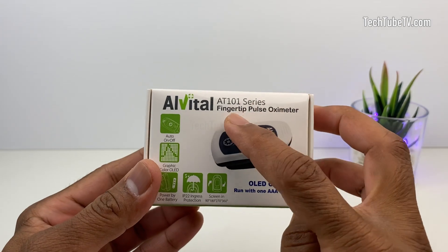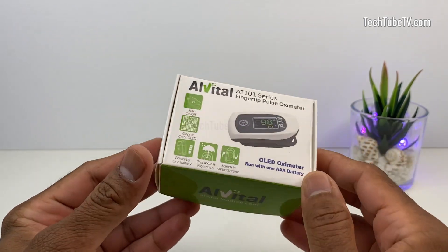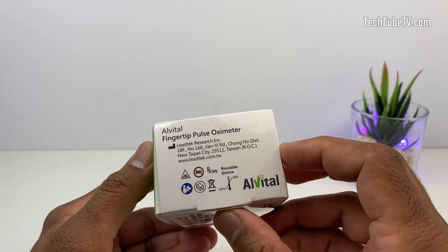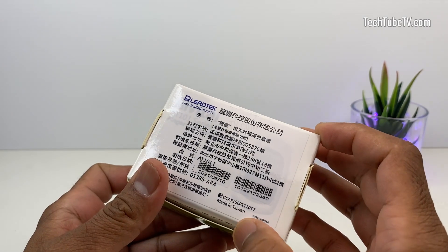This model is called the AT101 series. It comes in a pretty simple looking box. On the box is the image of the pulse oximeter and mentions some of its features. The company that makes this product is based in Taiwan and the oximeter is also made in Taiwan.